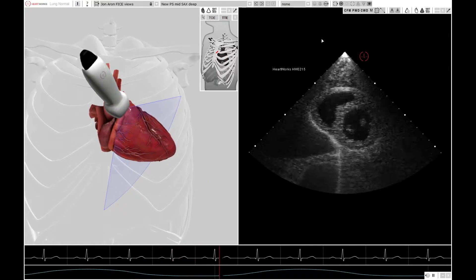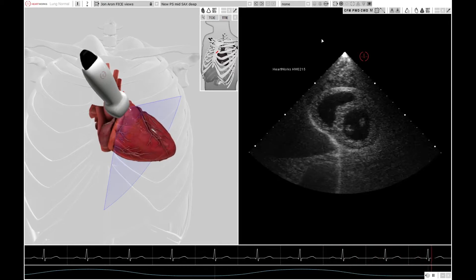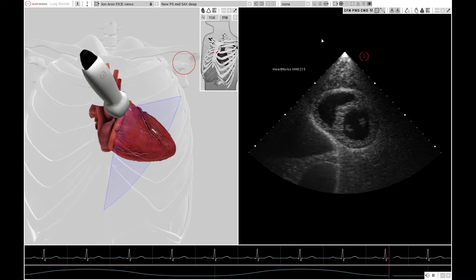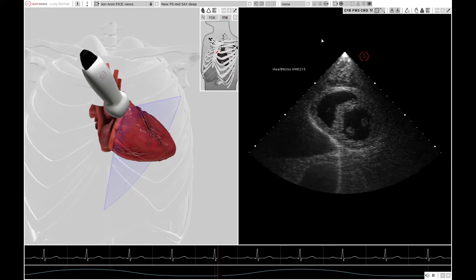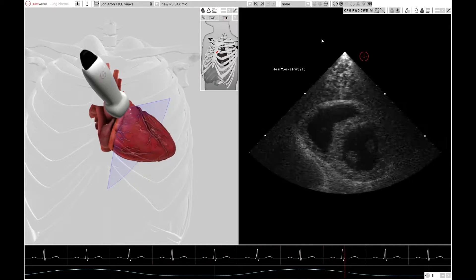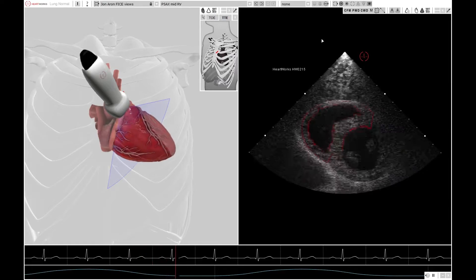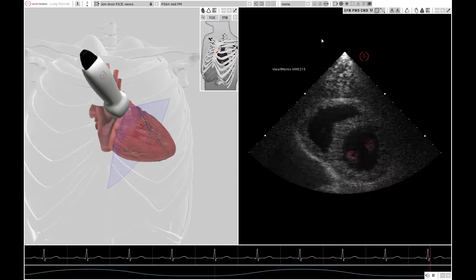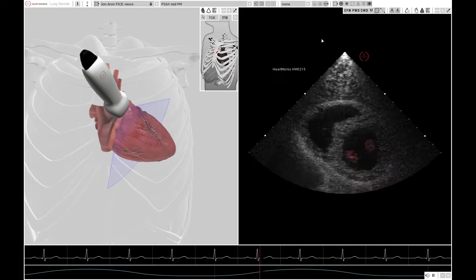Moving on to the next view — the same window between the ribs, but now looking at the heart in a short axis view. This is called the parasternal short axis view, achieved by rotating the probe 90 degrees so the pointer is now pointing towards the left shoulder. This image often needs optimising by decreasing the depth and changing the focus point. The structures you see are the right ventricle, the left ventricle, and crucially the papillary muscles, which identify the landmark to ensure you are imaging the correct portion of the left ventricle.